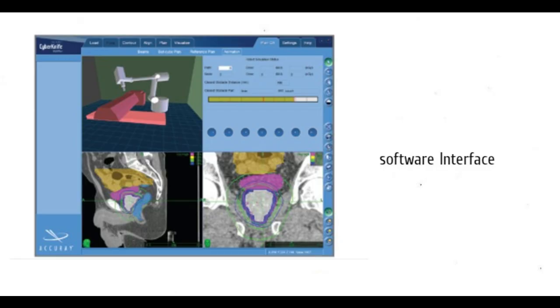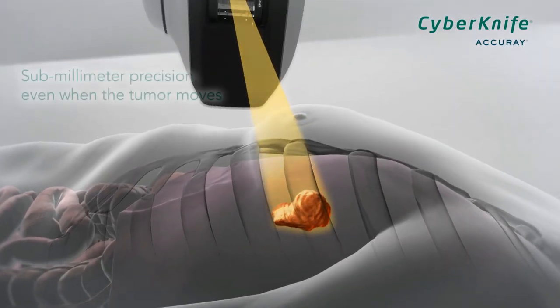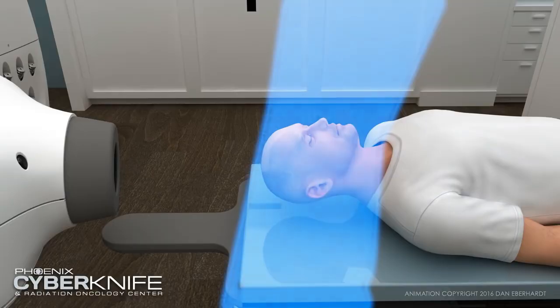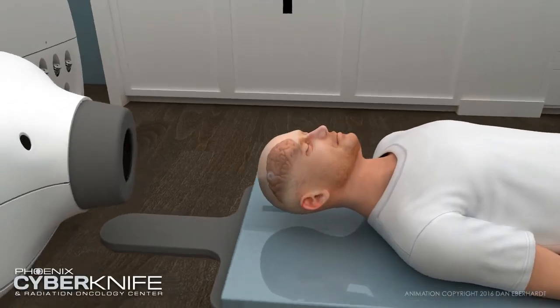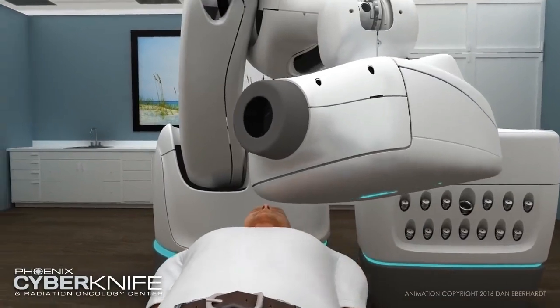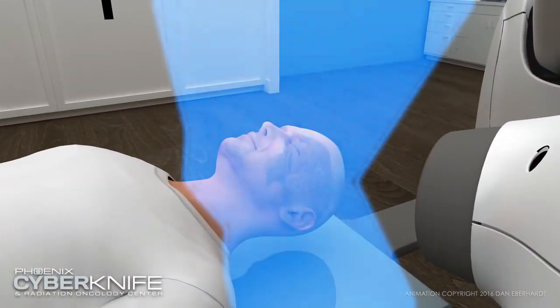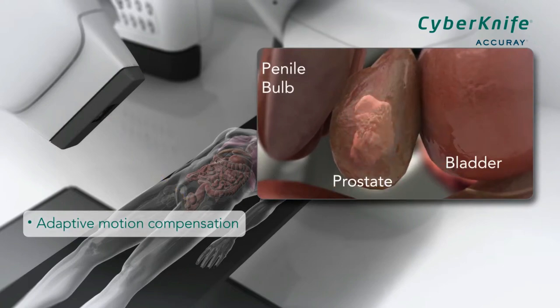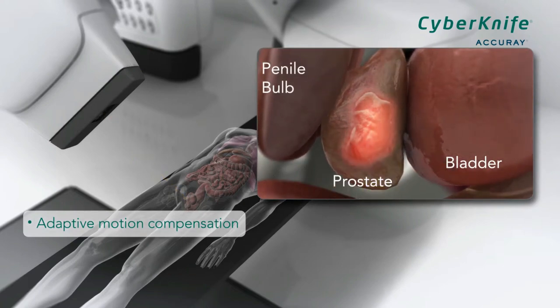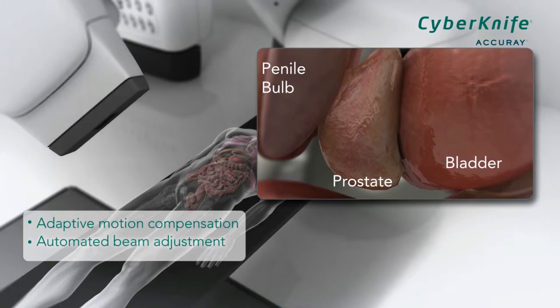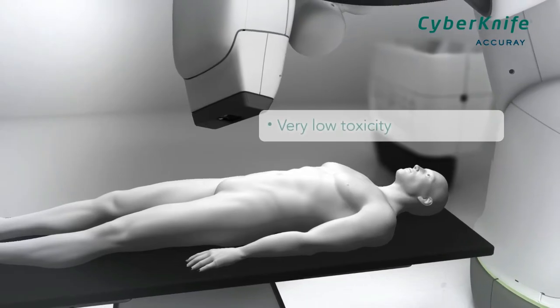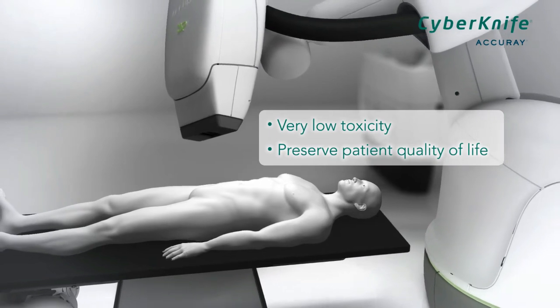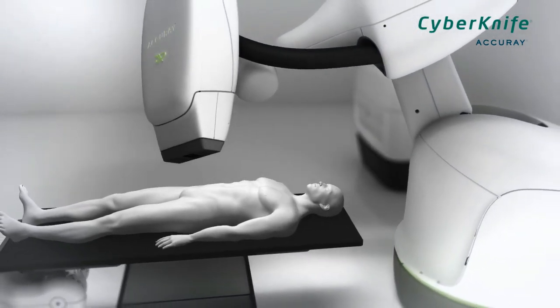Let's look into the applications of a CyberKnife. The CyberKnife system is a non-invasive treatment for cancerous and non-cancerous tumors and other conditions where radiation therapy is indicated. It is used to treat conditions throughout the body, including the prostate, lung, brain, spine, head and neck, liver, pancreas and kidney, and can be an alternative to surgery or for patients who have inoperable or surgically complex tumors. CyberKnife treatments are typically performed in one to five sessions. The CyberKnife system has more than two decades of clinical proof and has helped thousands of cancer patients.